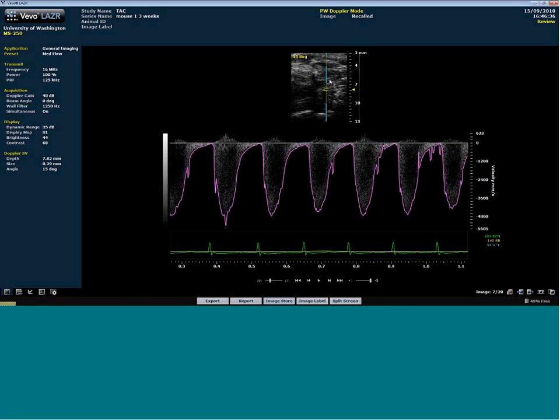When you get to that high velocity, on the Doppler line, you will see these teal bars here. On the 770, you would actually see extra gates, extra sample volume gates here. Those teal bars, and there's actually an extra sample volume gate just out of view here. You can't quite see it. That's due to pulse wave Doppler physics.